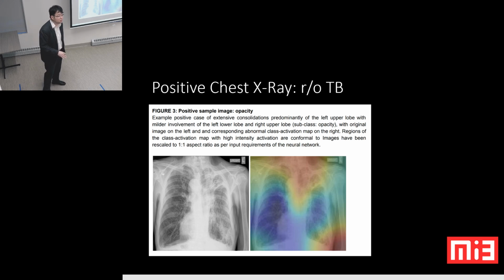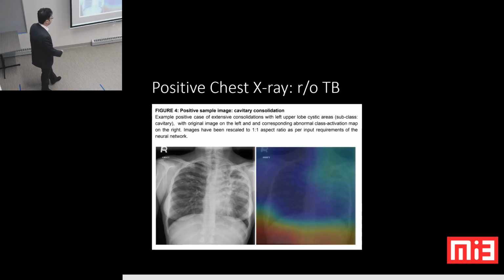There are limitations to this. We know that these do not work in a lot of different cases. We have a lot of failure examples of misclassifications as well. But we're trying to see what is possible and what is not possible. And you end up with these things that look like heat maps, localization for a cavitary area over there, and some sort of form of activation.